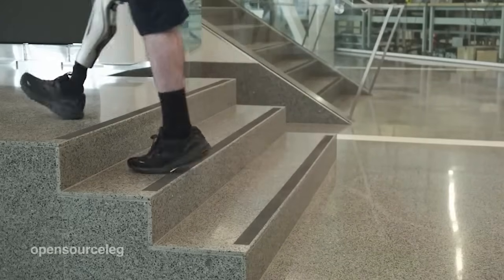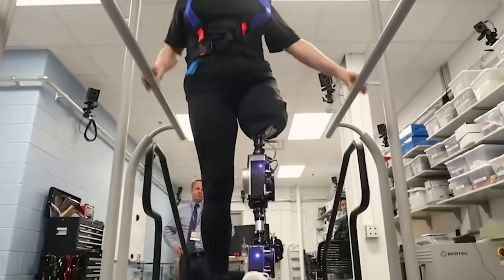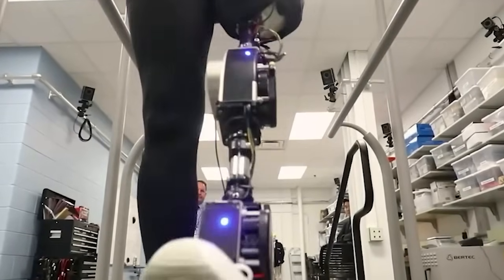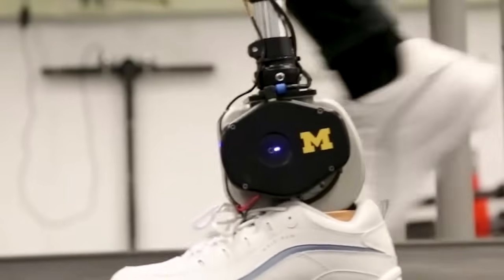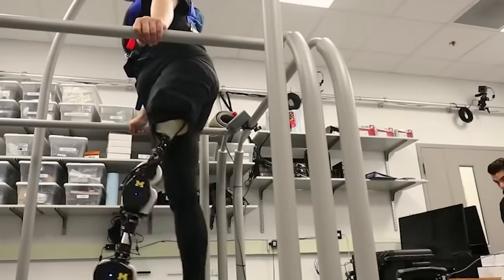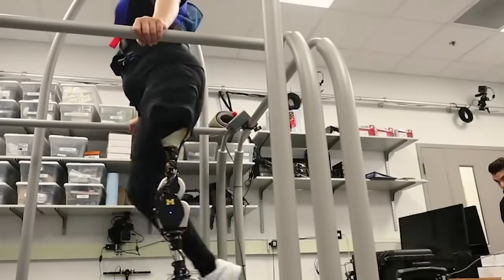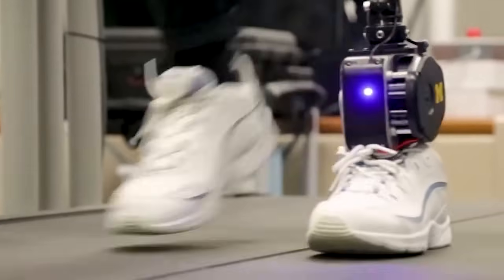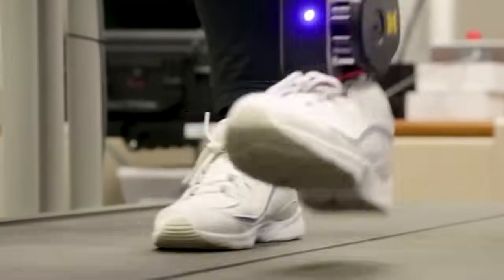Saving symmetric patient gait using the prosthetic is very tough. The development of motor control, level actuators, and control algorithms can transform the device into a powered active prosthetic leg. The development of the active prosthetic addresses some disadvantages of the passive one, from decreasing the duration of rehabilitation to reducing the psychological fear of falling.